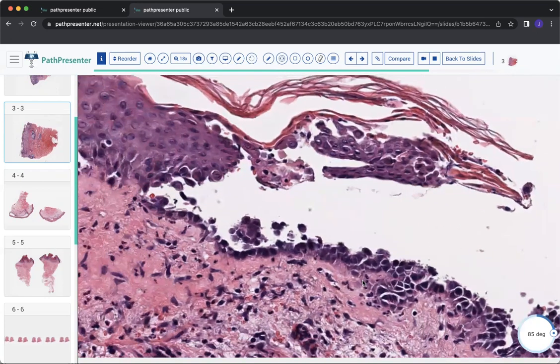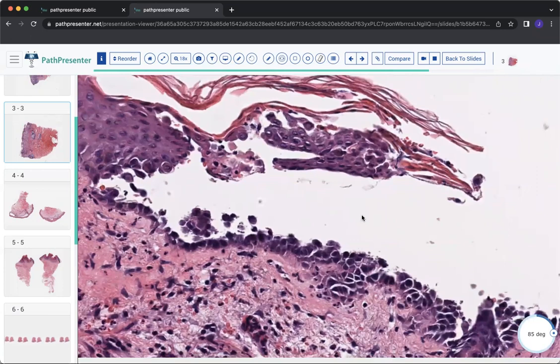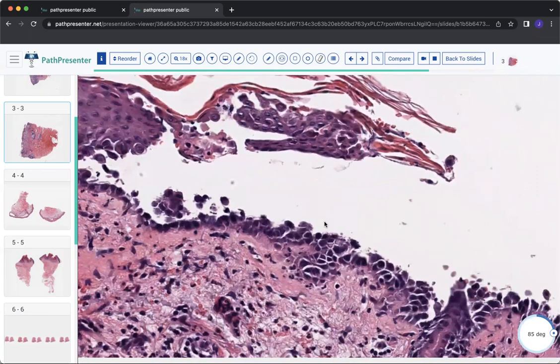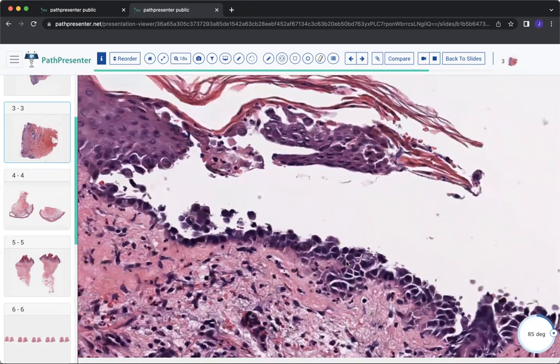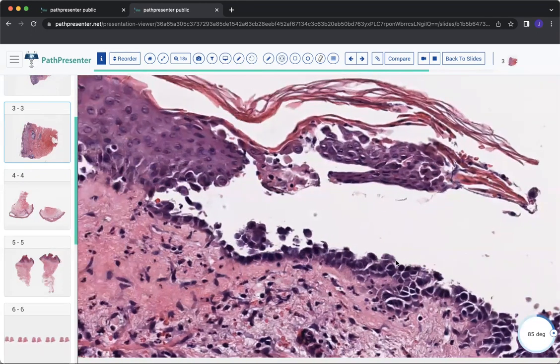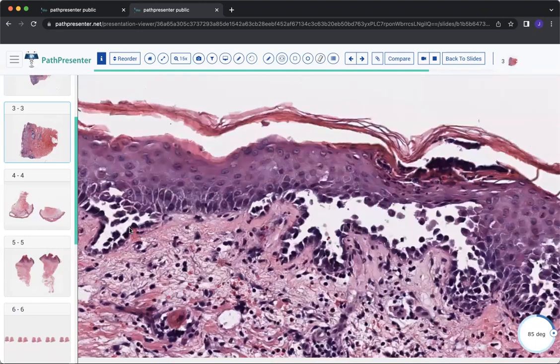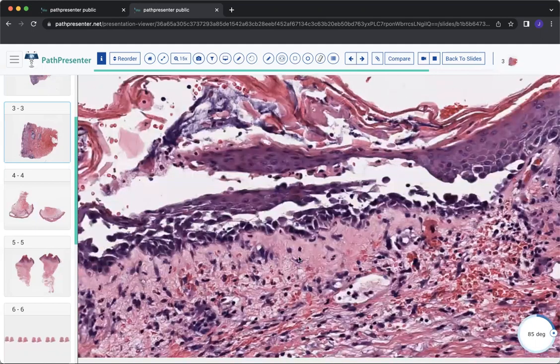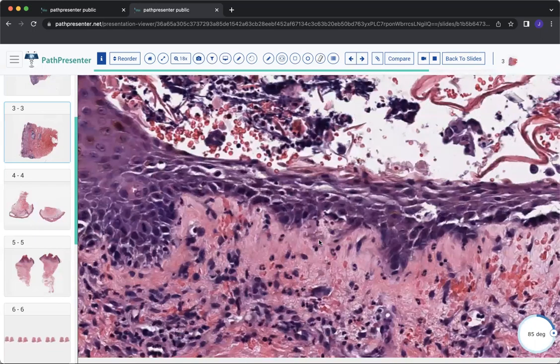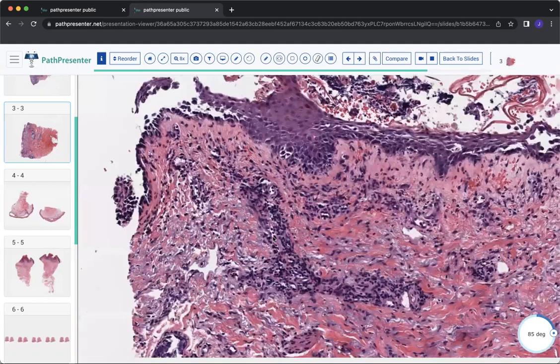So it goes to show you that if one calcium pump is messed up, then you lose the calcium homeostasis and you get at least a form of acantholysis. So the ATP2C1 is mutated in Hailey-Hailey here, and it results in this acantholysis, and it's a dilapidated brick wall appearance, and it doesn't have much dyskeratosis. So the other thing that will help you is if you don't see definitive hair follicle involvement that supports Hailey-Hailey. This doesn't have a ton of hair follicles to look at here.